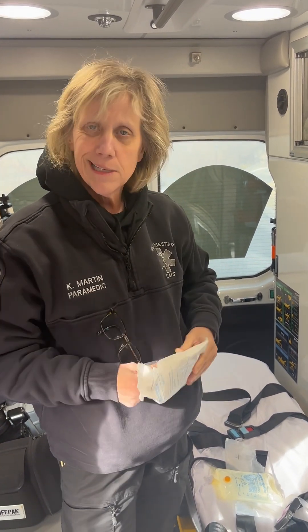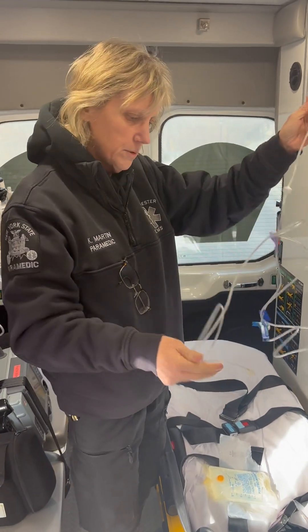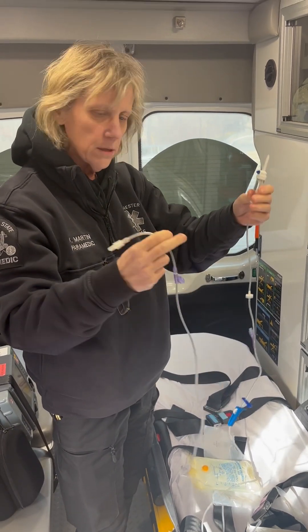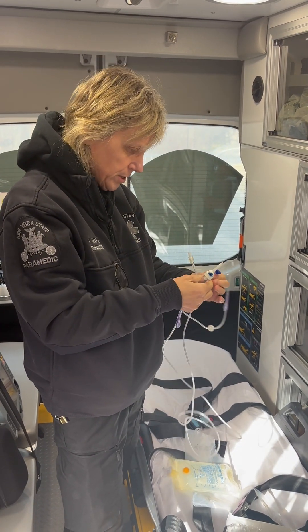I'm not using any gloves right now because I don't have a patient, but you would have gloves on normally and you'd try to keep everything pretty sterile. The big goal here is to get rid of the bubbles in this line — these tubes. You don't want the bubbles going into the person's body.